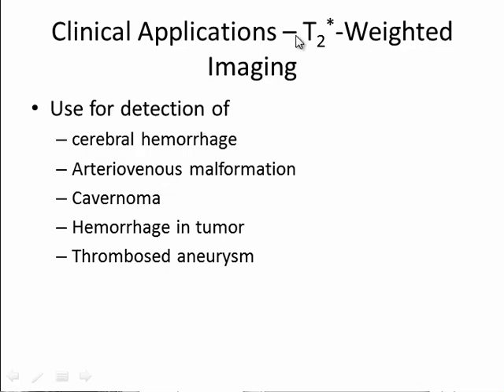And since T2 star weighted imaging is sensitive to dephasing, it ends up being sensitive to that hemorrhage.